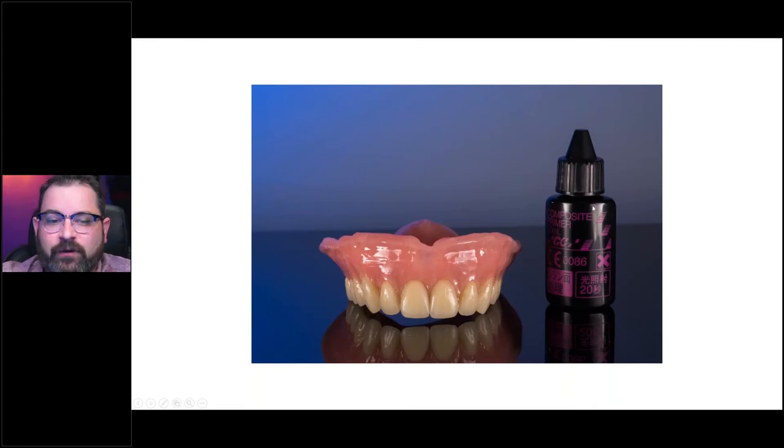The reason we don't use alcohol on acrylic is because it can create microfractures. But with printed restorations it's not an issue because we already clean them with alcohol during post-processing. Once you've done that, a very important step is the composite primer. With the composite primer, it creates that little sticky layer that allows your composite to be added on.